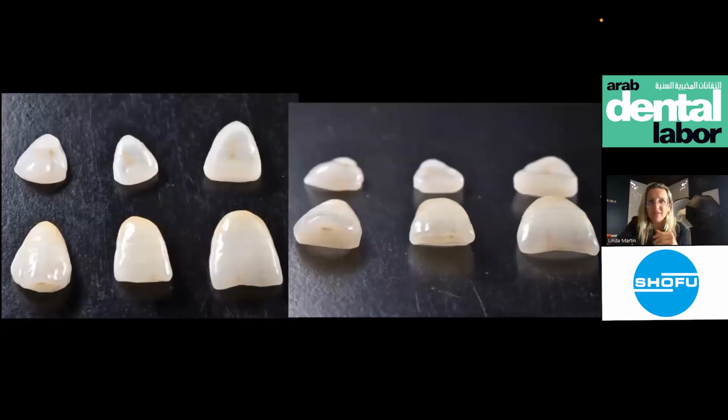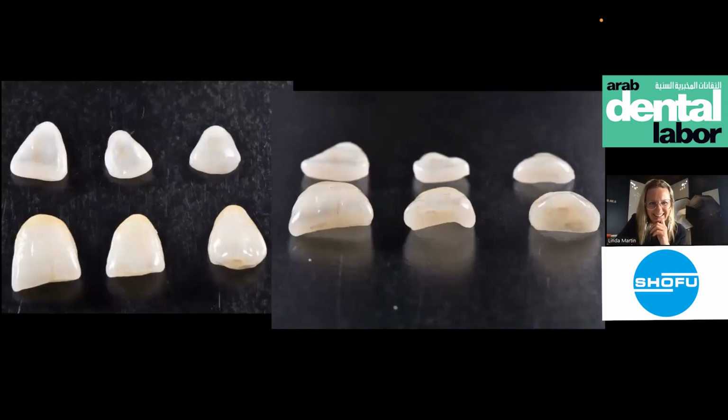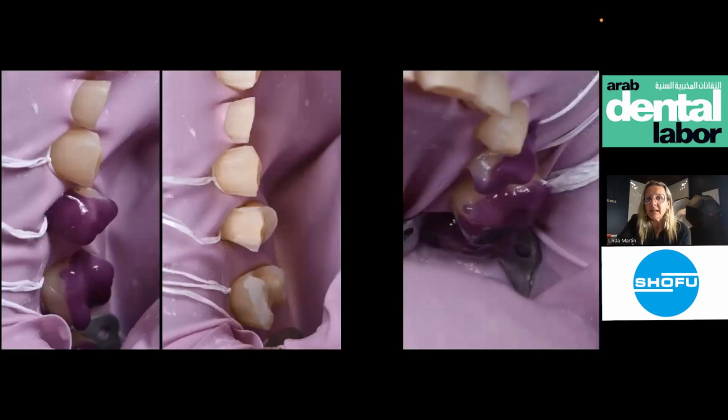You can see you have just the palatal veneer in the front for occlusion and the buccal ceramic veneers, complete for aesthetic in the incisal. You can see two different veneers per tooth. So posterior, I bond always, always, always with a rubber dam. Isolation is the key. Without isolation, you can't bond for the long term. You need isolation, really important.